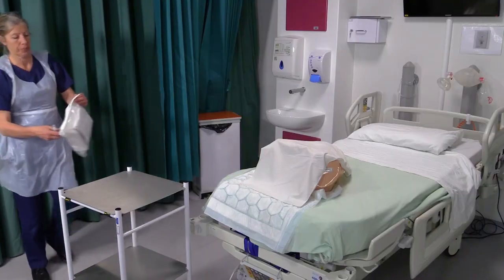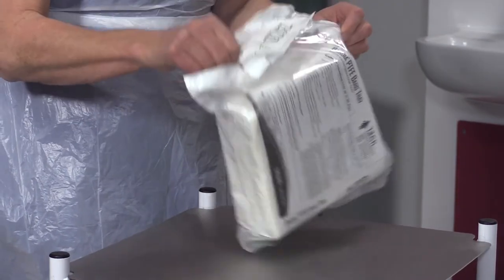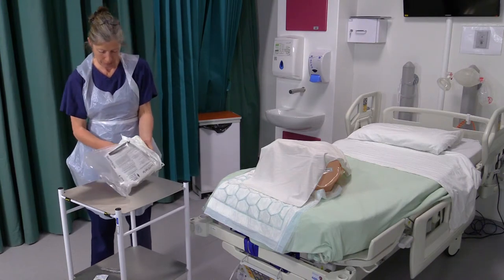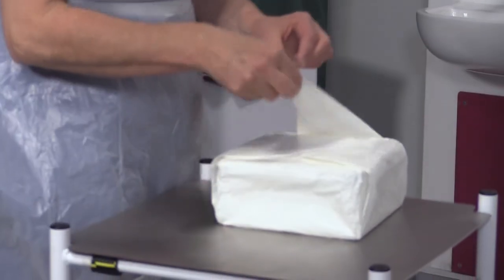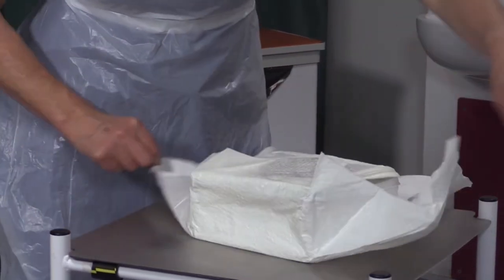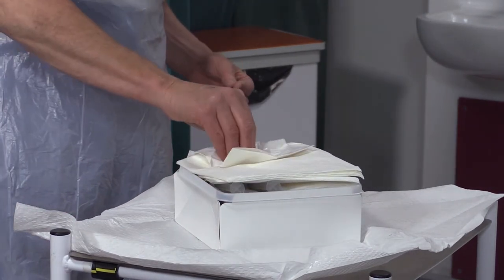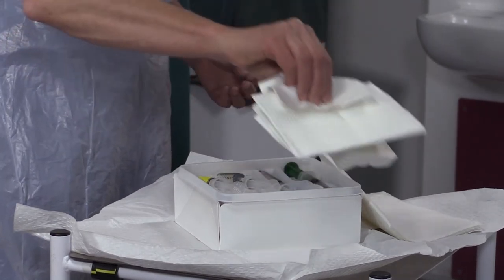And open your pack onto your clean surface. Your pack may contain everything that you need inside. Once you have opened your pack, rearrange all your equipment on your sterile surface.